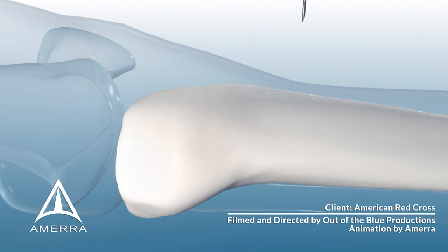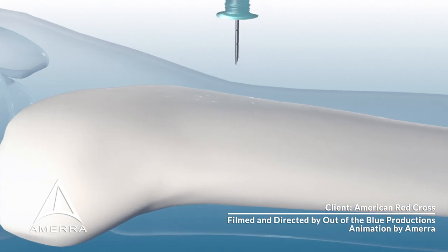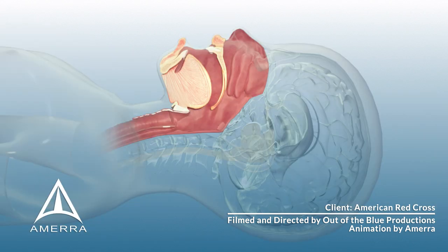Make sure to insert the needle away from the growth plate found at the ends of long bones in younger children. Push the needle through the skin until the tip is against the bone. The 5 mm mark on the needle must be visible.